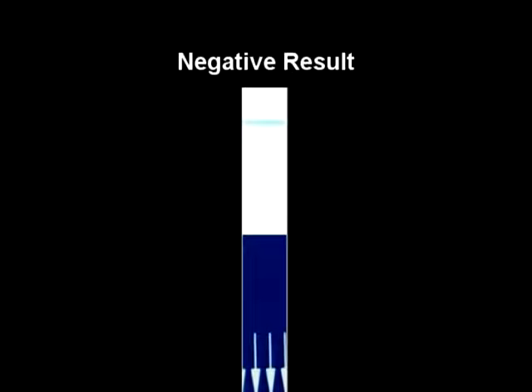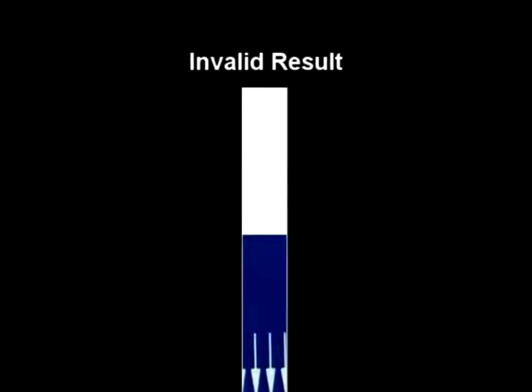The appearance of only the blue control line means that the test is presumptive negative. If the blue control line does not appear at 15 minutes, the test is considered invalid and the test result cannot be used. If the test is invalid, a new test should be performed.